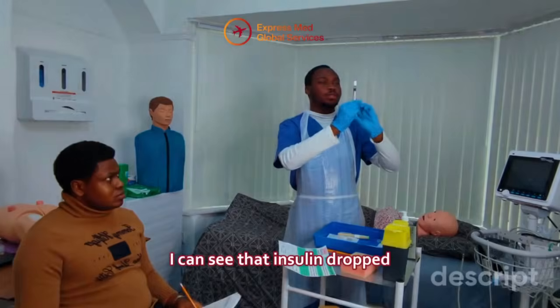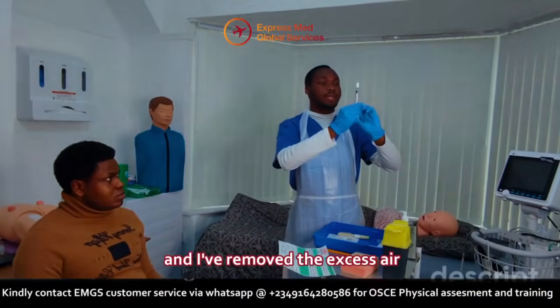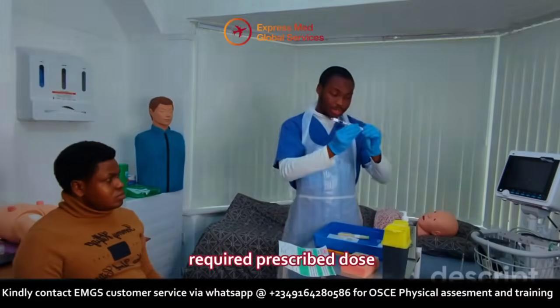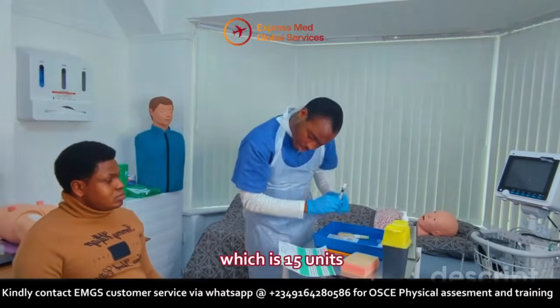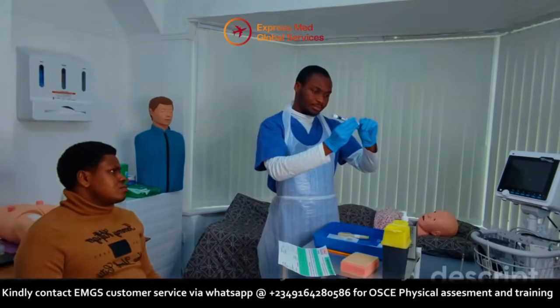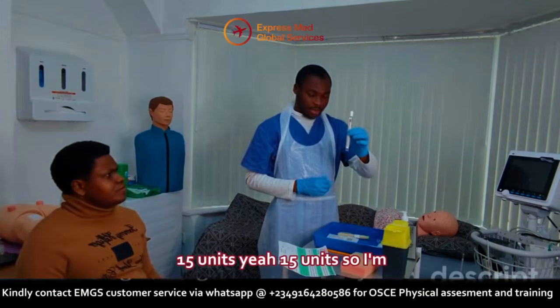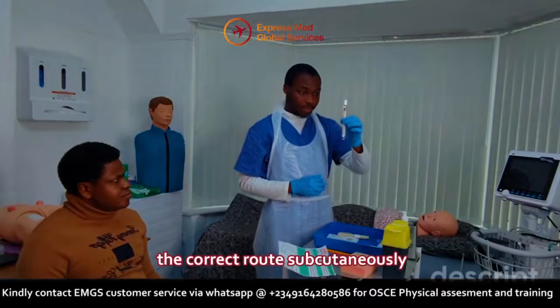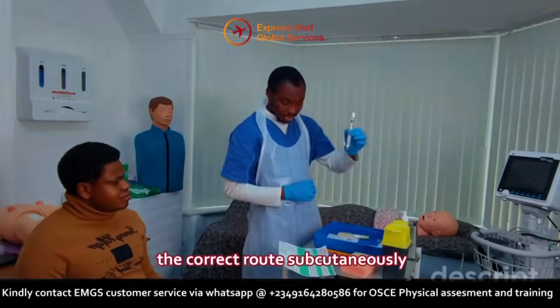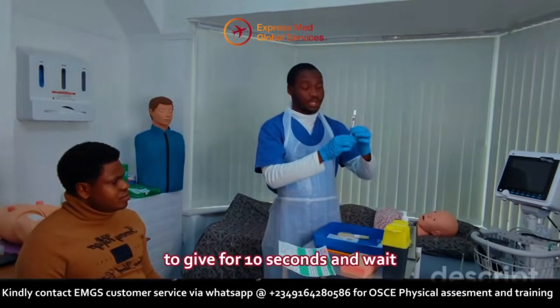Then I can see that insulin dropped from the needle. I can confirm that it's working, and I've removed the excess air. So I'm going to take it to the required prescribed dose, which is 15 units. So Assessor, can you confirm it's 15 units? Yeah, 15 units. So I'm going to give this subcutaneously, the correct route, and I'm going to pinch the skin and go at an angle of 90. I'm going to give for 10 seconds and wait for 10 seconds.